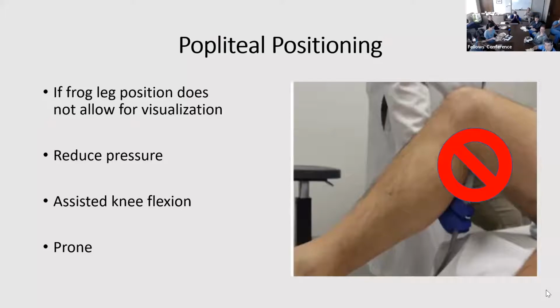I put the big stop sign on this because you don't want to hold the patient's knee up with a probe. You will collapse the vein every time and you won't be able to visualize it. So don't do that.